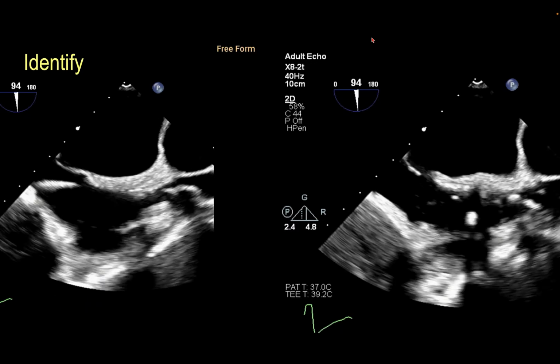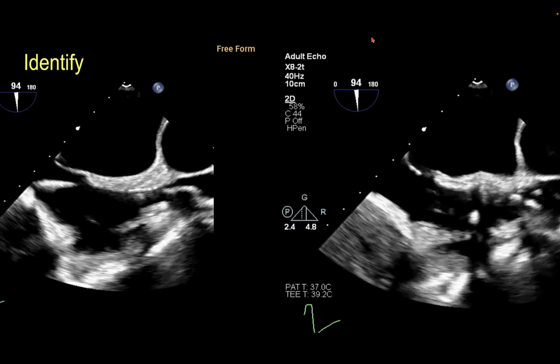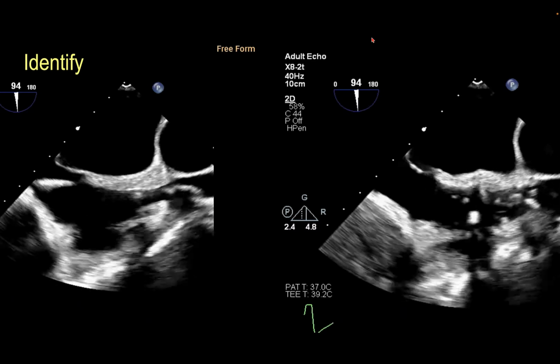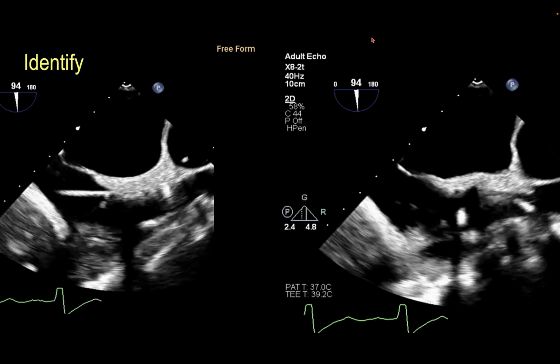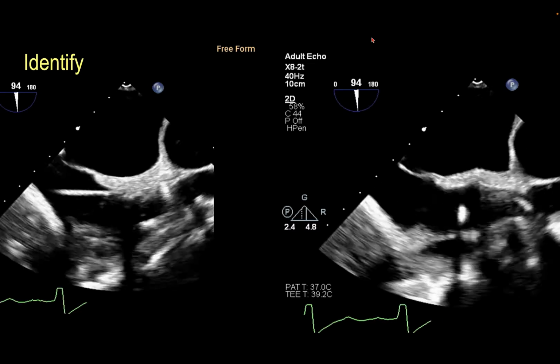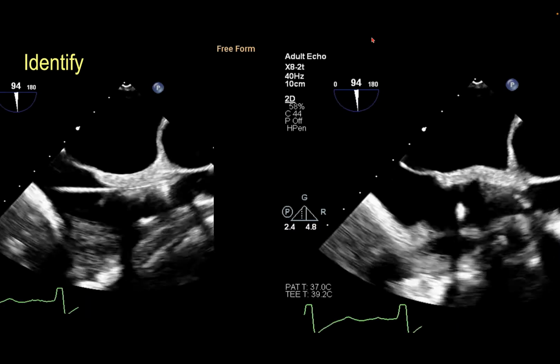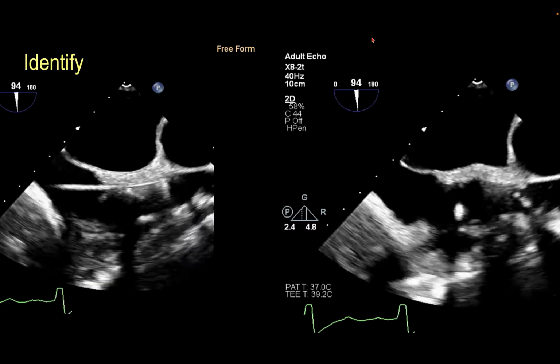The next phase we refer to as the identification phase, or identify the needle. This becomes even more important when we have a lot of traffic issues in the right atrium. There's small real estate and imaging artifacts, making it difficult to identify the needle coming in from the transseptal puncture. The one trick that we use is to establish the continuity of the needle coming from the IVC into the right atrium towards the SVC.